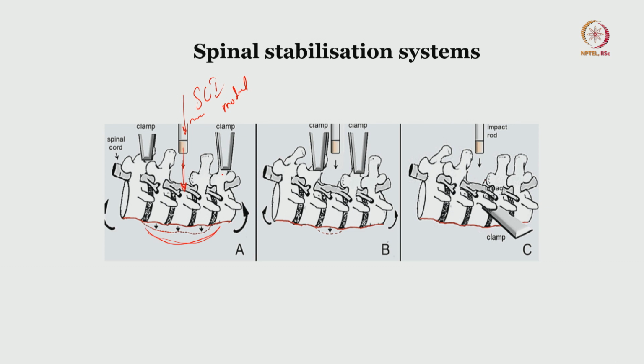Closer to the area of surgery, less will be the movement. As you can see, when the clamp is applied to the top and bottom, the movement is much more than when it is next to the laminectomy level. However, if you see, the movement is absolutely nil when the fixating bar goes underneath the transverse process.